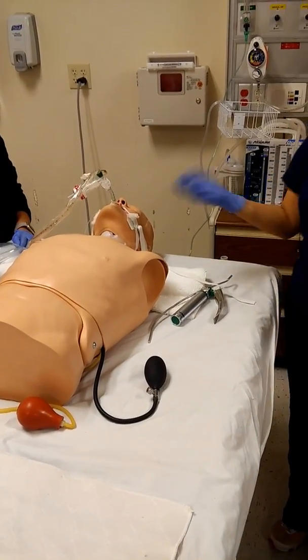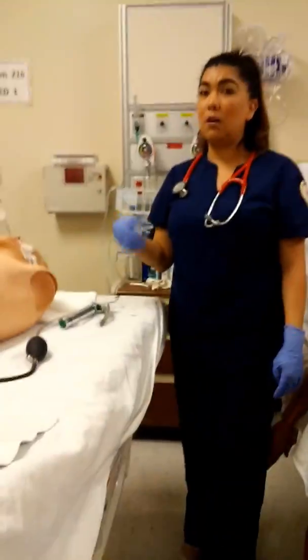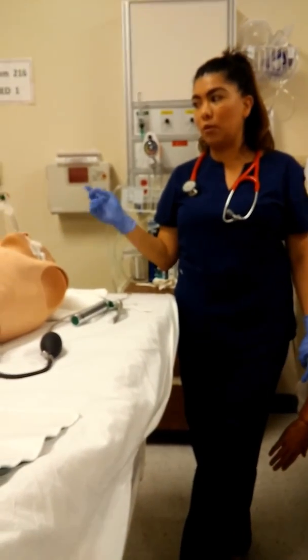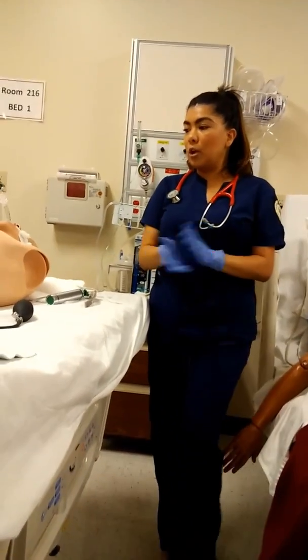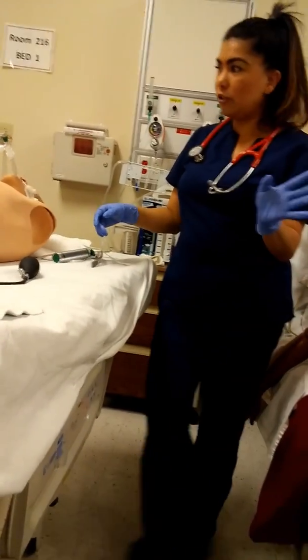Now, if the patient were to be intubated for a long period of time, we want to avoid a long period of intubation, because if they were to be intubated for a very long time, then that could cause vocal cord paralysis, vocal cord necrosis. We also want to assure and so we want to avoid that.